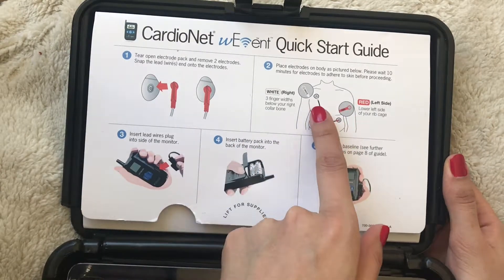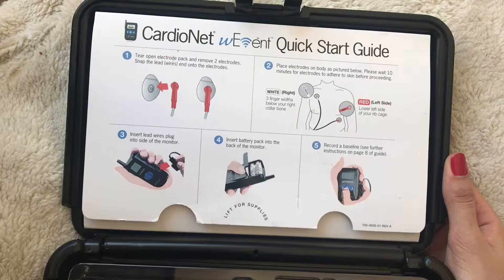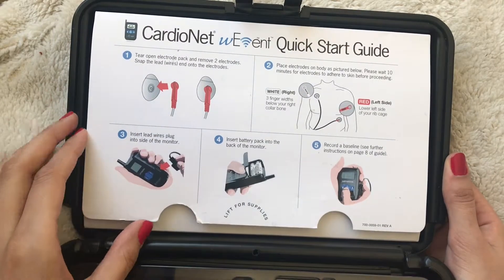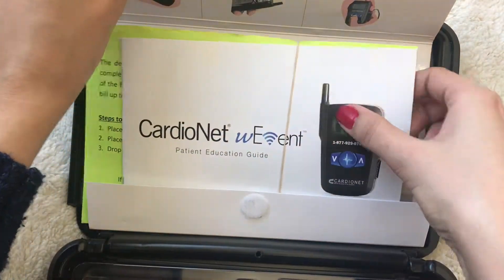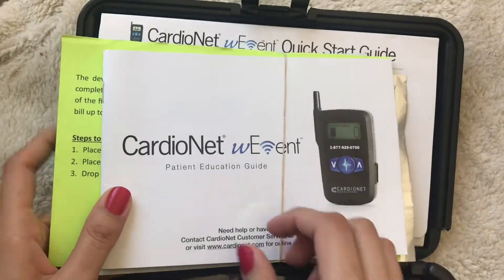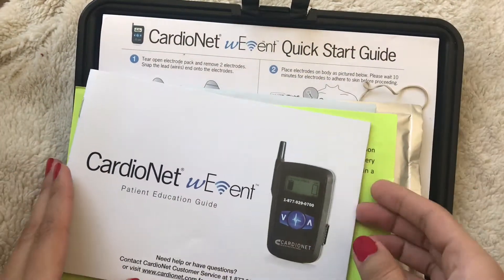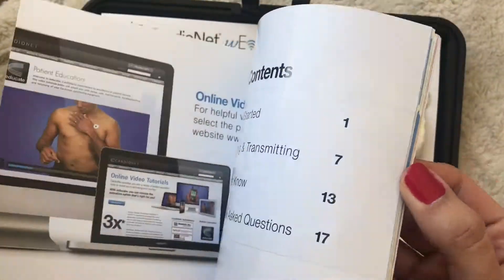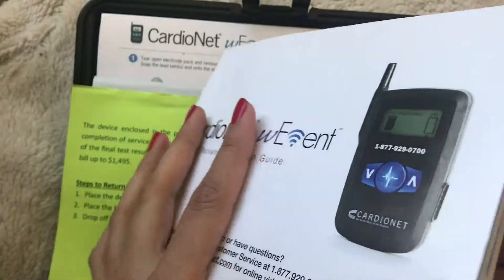The quick start guide shows you where to place the electrodes on the chest and how to place the leads into the electrodes. It's a really brief summary of how to work the Holter. Inside they also provide a patient education guide, which is a more in-depth explanation of the Holter monitor. It gives some tips, some reminders, and some questions and answers, so I recommend giving it a quick read-through.